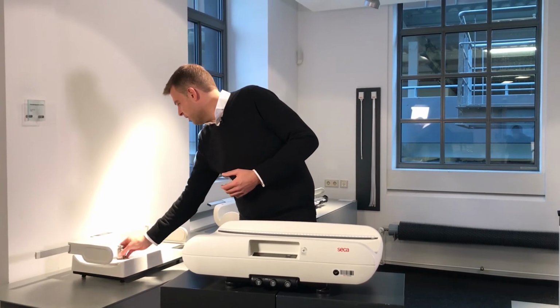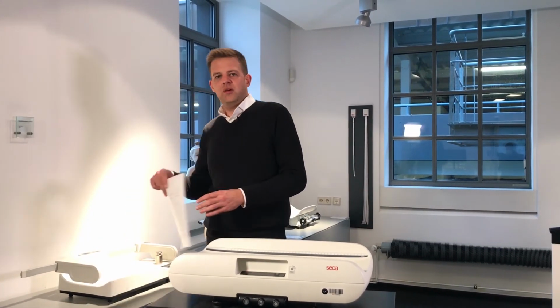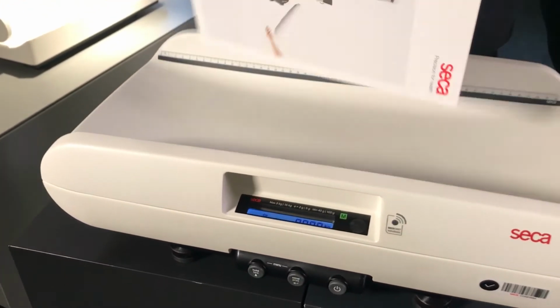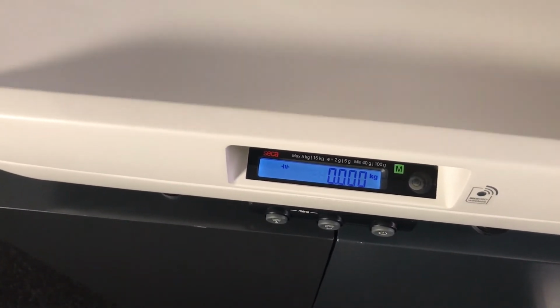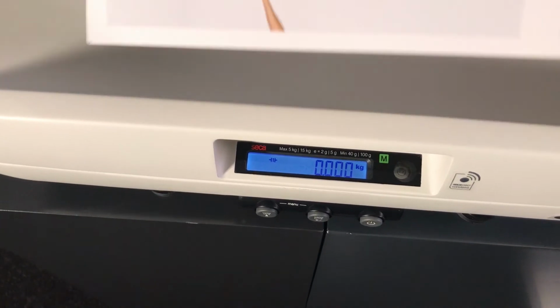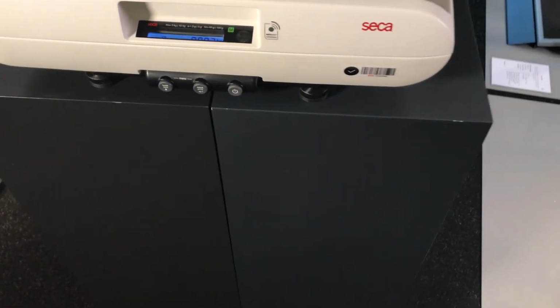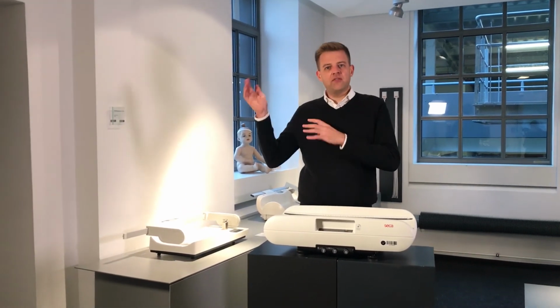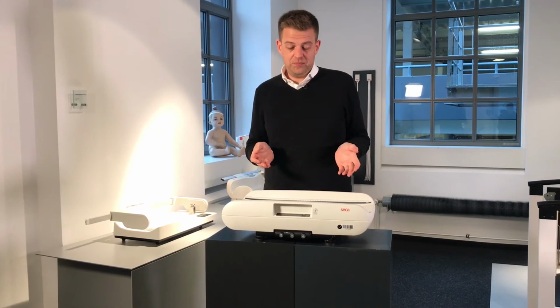I will just show you why I ask you to tare the scale if you use some paper, which will basically show you how sensitive the scale is. I will pretend that I'm making a bit of wind on here, and you will see that this wind actually has an impact on the weight displayed. We actually had a use case where a customer would complain that this scale wouldn't find the perfect weight, but it was actually positioned under an air vent, which was constantly blowing air onto the scale, which made it go crazy.